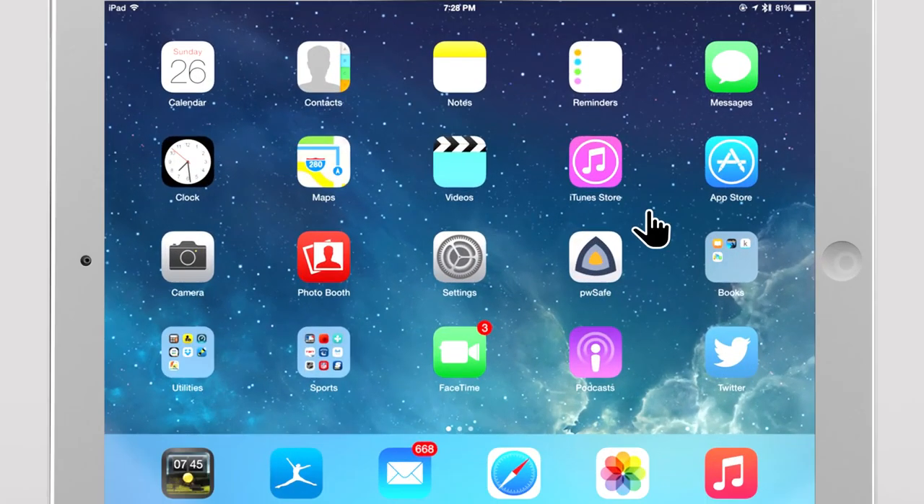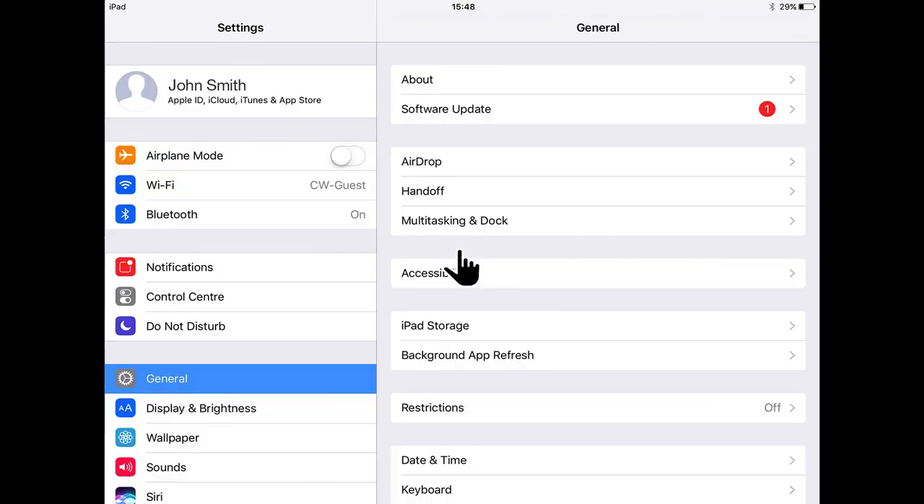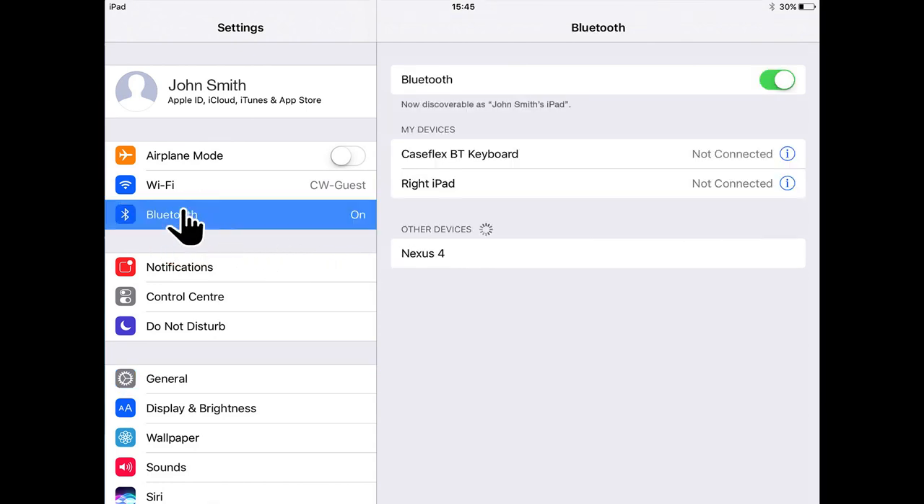On the Apple iOS device, locate and open the Settings app. On the Settings app screen, select the Bluetooth option. A list of other devices should appear and one of them will be R-Net iDevice 1. Select R-Net iDevice 1.